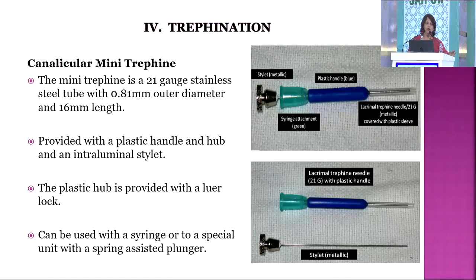Now, what I wanted to stress in this talk was the technique of trephination, which I have been doing for the past 4-5 years. I did a thesis also, and it has given pretty good results with an easy technique. Again, it can be learnt and done by a general ophthalmologist also.